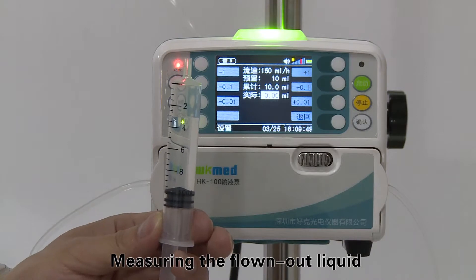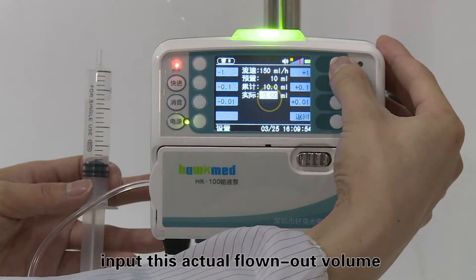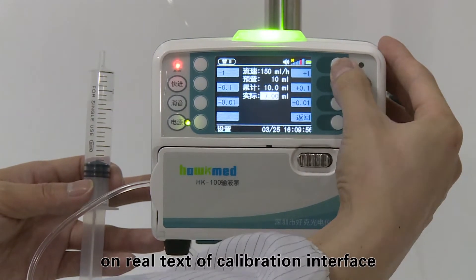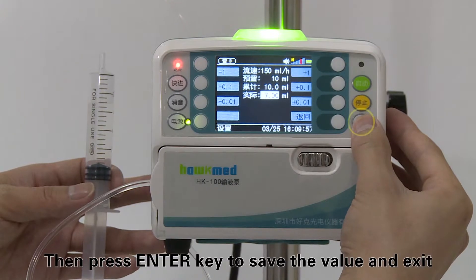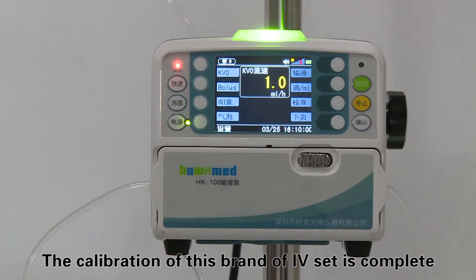Measure the liquid that has flowed out into the syringe or measuring cup. Input this actual flowed-out volume in the real value text field of the calibration interface, then press the enter key to save the value and exit. The calibration of this brand of IV set is now complete.